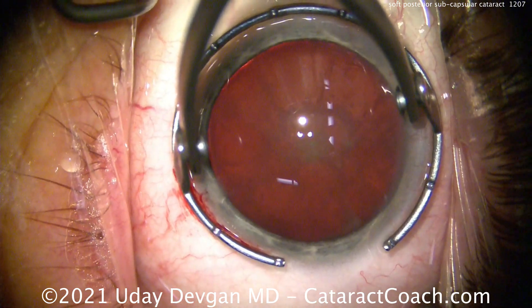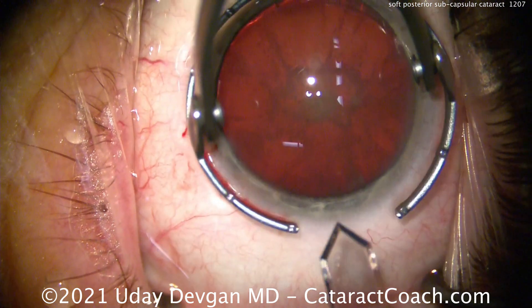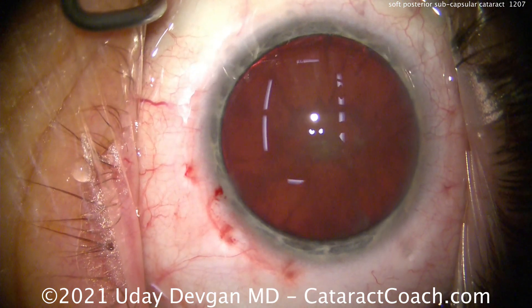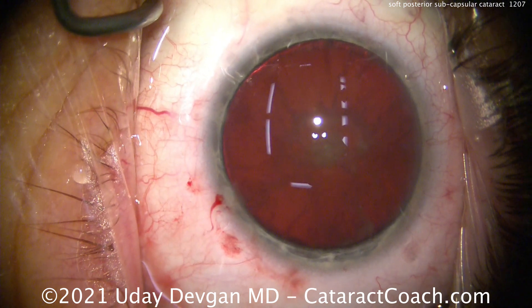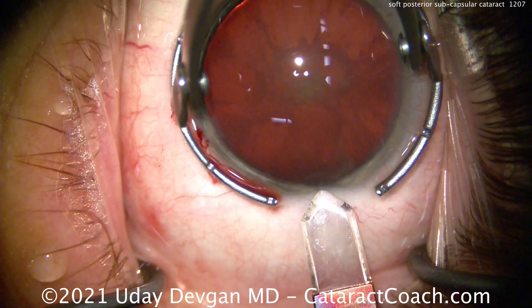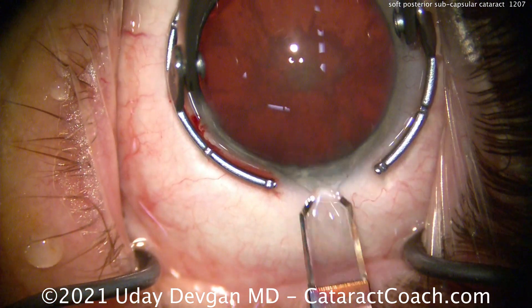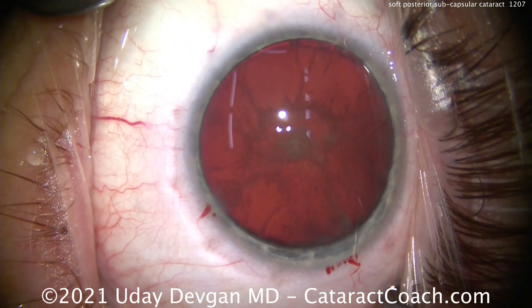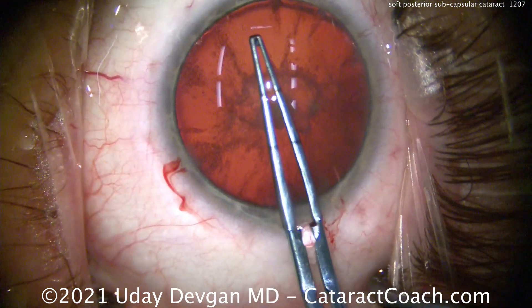Making the main incision with the diamond keratome, taking our time to get it just right — barely nicking the limbal vessels, which gives the best long-term healing. We pause to add a little more dispersive viscoelastic to raise the eye pressure slightly, so the incision is absolutely perfect. Back with the diamond keratome: a great starting point, advancing slowly for good tunnel length, entering the anterior chamber perfectly. A little bit of bleeding at the limbus — that means great long-term healing.